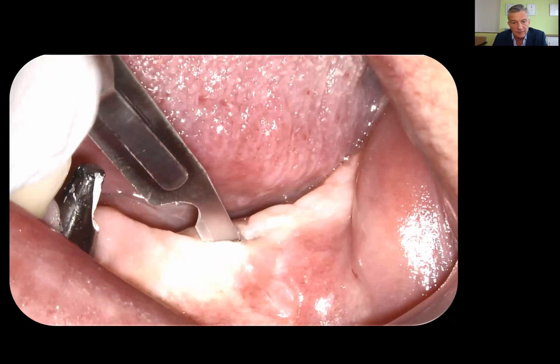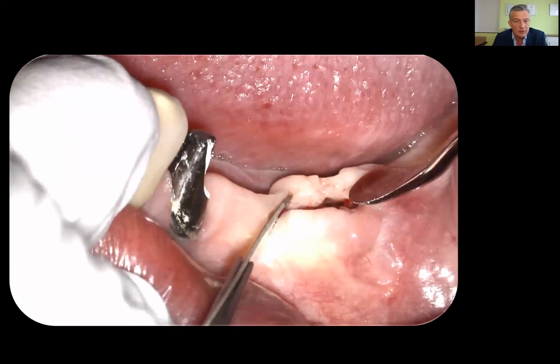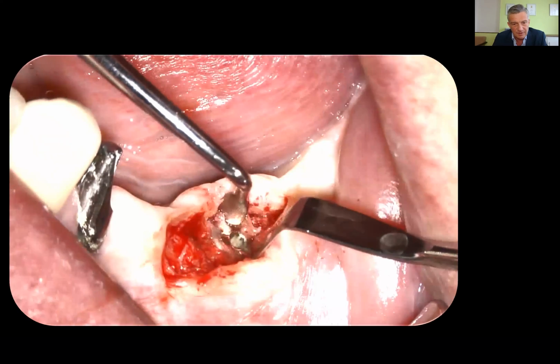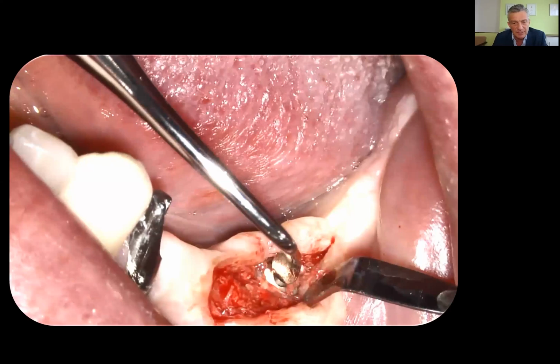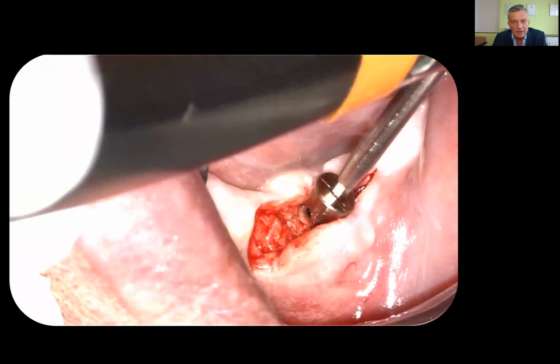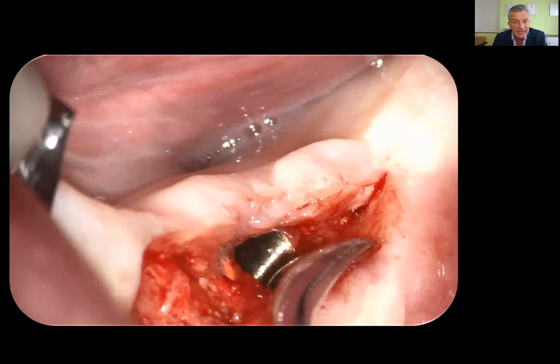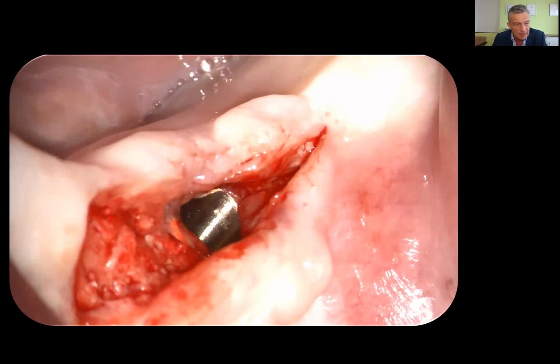And now to give you a feeling of the bone, I guess a video is better to allow you a realistic assessing of the situation. And we find a hard bone, removing the cover screw, and now we are able to save the old restorative parts and to replace them. And this is a big advantage of this method.